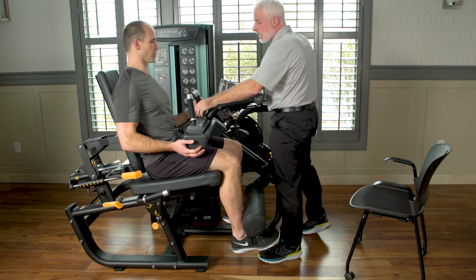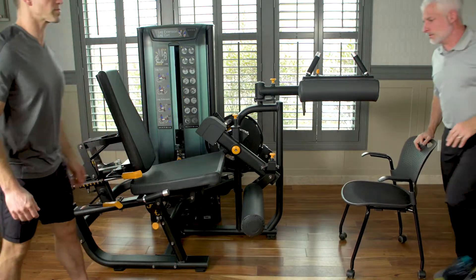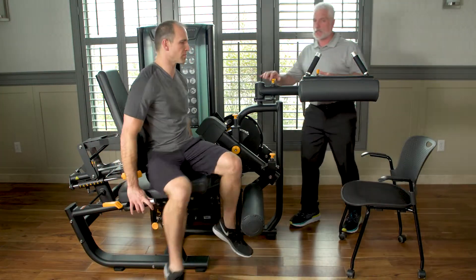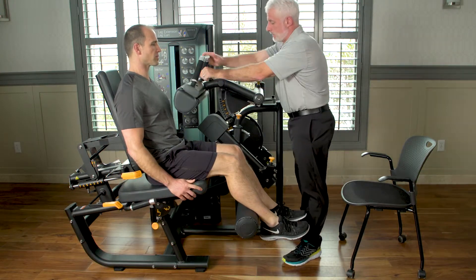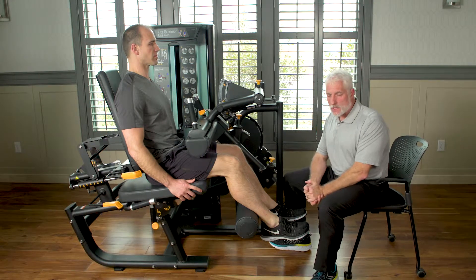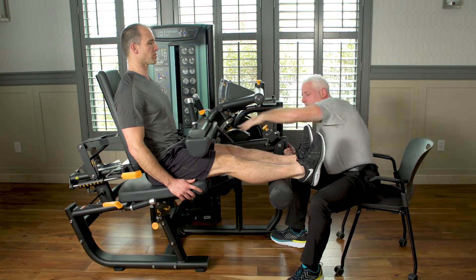We're going to reverse the process: this will be pushed up, this will move over — easy exit. Then we switch this lever, pull it up, and knock it down. That's going to line up the axis if we're going to work hamstrings. The difference here is we need to change the angle for hamstrings, whether the patient population is a meniscus tear, ACL, total joint, or even hip replacement. By pulling up this knob, you can bring their legs up to the appropriate position.